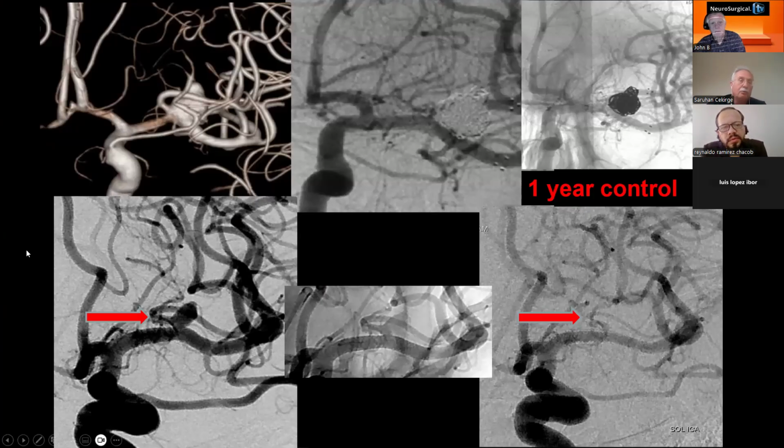However, look, two very similar aneurysms. Left MCA, superior trunk is coming off, and the Y-stent-assisted coiling, okay, good result. And another left MCA, where the superior trunk has a worse angle, and just simple pipeline placement and 1 year control. So what happened to that superior trunk? We call it class 1B occlusion. It got thinner because of the flow demand. This patient is not symptomatic.